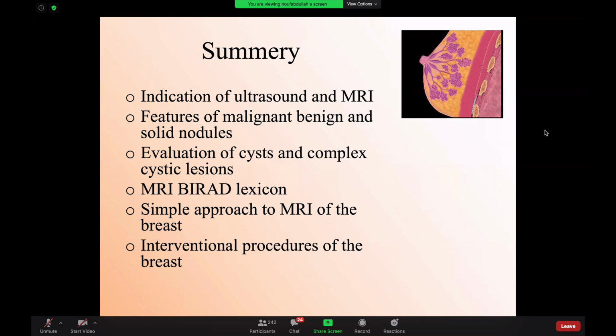And based on that, you will look only for the enhancement on the early phase. But in cases of diagnostic, we have to do the 6 or 7 or 8 minutes protocol, which will give you an idea about the wash-in and what happens later on. So what I would advise, for exam purpose, you should know the kinetic curve analysis of the lesion.